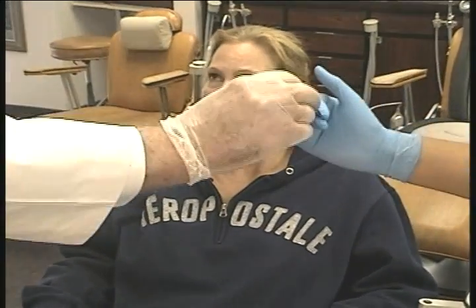Okay. Her opening has increased to 46 millimeters. Yesterday it was 41 millimeters. That's a 10% improvement, just like that. We're going to do a final adjustment and then send this young lady back to Cleveland.